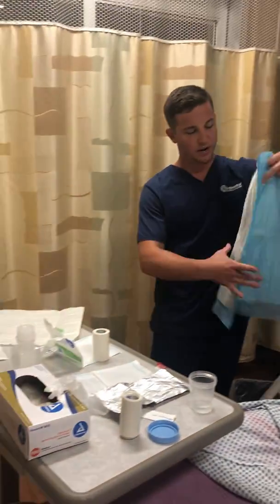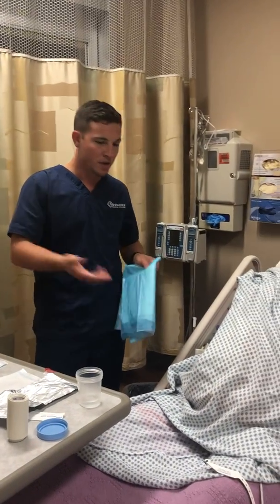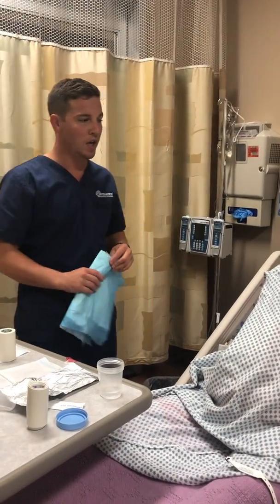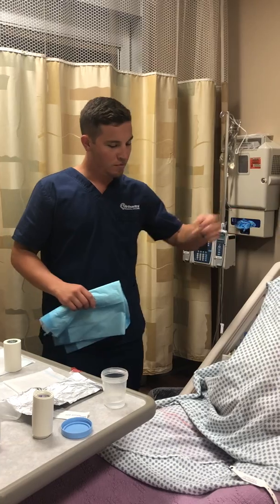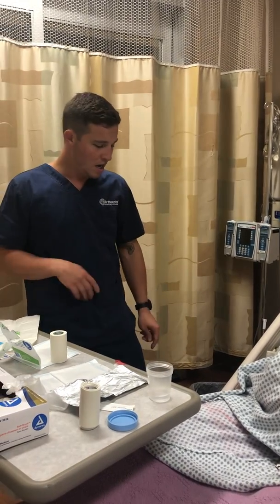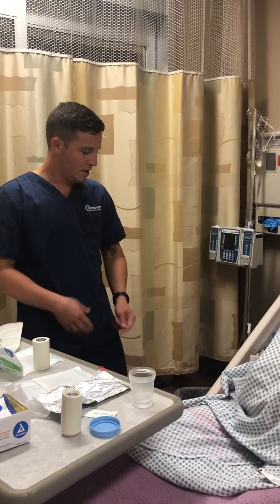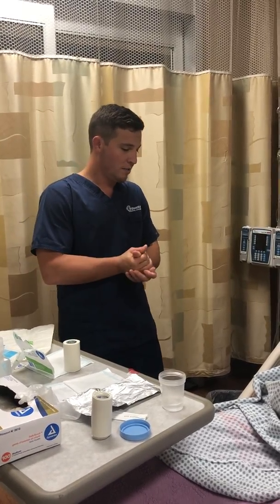I'm going to clean up my area, and I'm going to ensure safety with my patient. You know, low bed, floor mat, call light, bed rails up. With my chest tube, I want to make sure there's no dependent loops. Make sure that it's upright. I'm also going to keep them in a semi-Fowler's position to promote drainage.